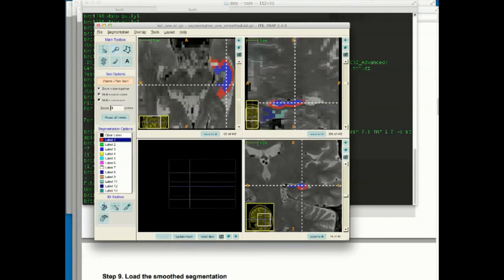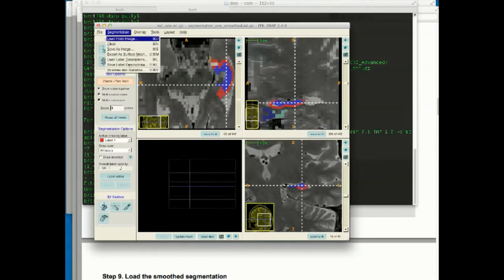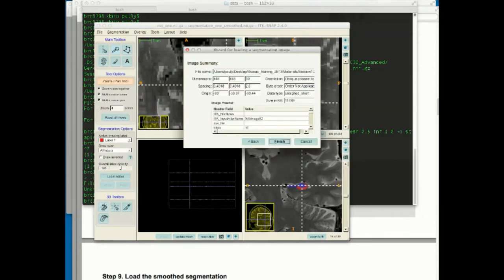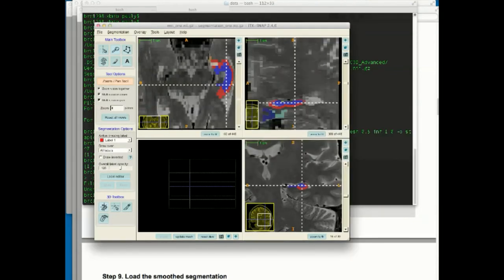This might be a little confusing, but I'll still mention it. In our original segmentation, let me load that, segmentation 1. Okay. So the highest label that is there, the actual label number is 13, but we don't have 13 labels. So some of the numbers are missing.